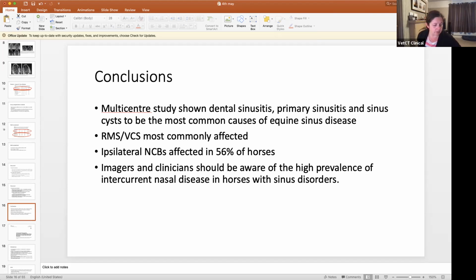So, interesting. Yeah, I think it is interesting. We'll see. I mean, certainly in my limited exposure to scoping these, you never see obvious fenestrations or rupture when you're sticking the scope up in the middle meatus, but that could be my lack of skill with an endoscope. And you don't ever see actual holes in these, do you? You usually just see the fact they've withered away.